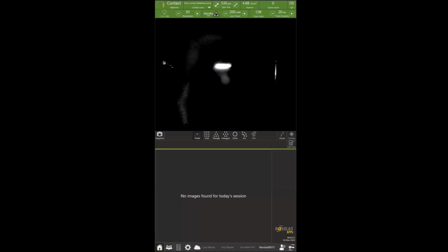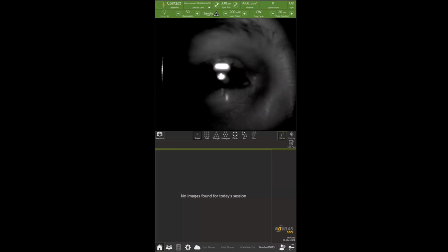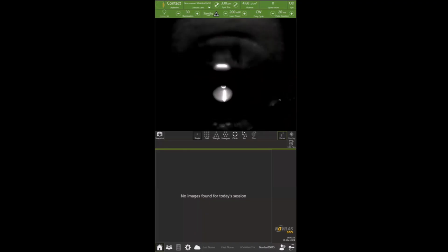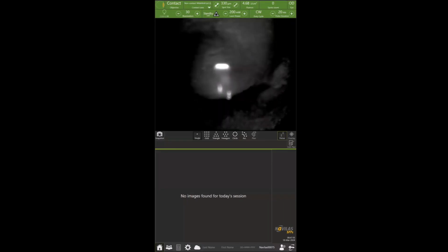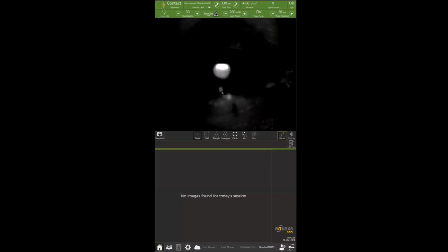So here is the example of far peripheral laser treatment simulation on my colleague's eye with infrared illumination. It can still be done as mentioned before. It's just that we do it this way in this case only because she does not have any mydriasis. This case nicely demonstrates the capabilities of the non-contact wide field optics Navilas has. You can see the pupil is not too big. It's also not too small, but it's not a pupil which you would call dilated.